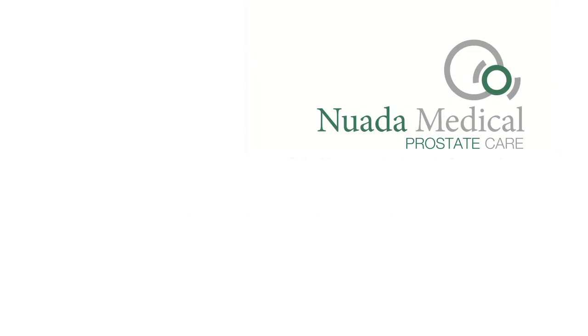We know from our experience that when we've biopsied the lesion that you can see on the MRI scan, invariably you get more cancer, more length of cancer in that core, and potentially higher grade disease as well. And you need to know if you're going to be able to advise that patient as to have the best treatment. And that's also corresponded when we've done radical prostatectomies. We found that the cancer found on the MRI would correspond to where the cancer was on the radical prostatectomy. So it's been very reassuring for us that we can use this technique in that sense.